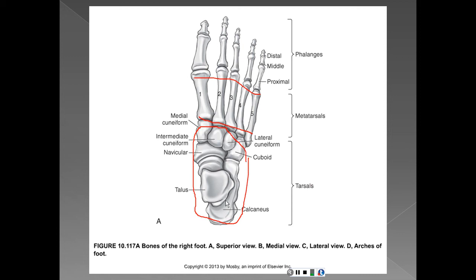And we have the calcaneus, the big heel, the talus, which articulates with the tibia, the navicular, which articulates with the first, second, and third cuneiform bones, and lateral to that is the cuboid. So when you do your lateral, you actually can see this little hook aspect of the cuboid. Many times you can have a fracture of the cuboid bone, where the muscle will pull the little tip of the cuboid bone right off.